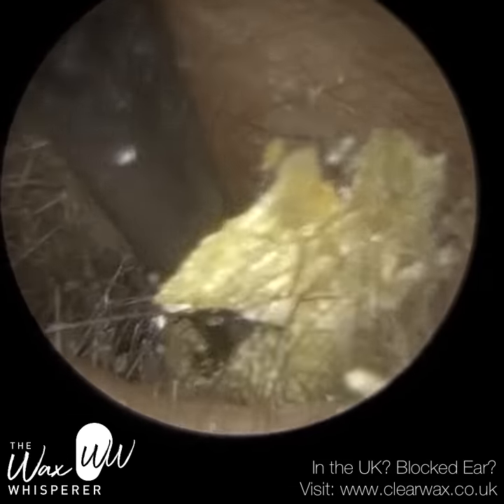I'm going to use the vacuum now. Almost identical to the left ear, it looks like a haystack. I'm going to wriggle it left to right and bring it through and out of the ear. It's just trapped there — I don't think there's a great suction grip because of all the hair. I'll revert to the ear hook to scoop it out. Going to the roof of the ear canal, I'll rotate and flex the ear hook to get in behind. There we are — I've managed to remove that. There's a bit of dead skin that got caught so I just decided to get that out of the way.